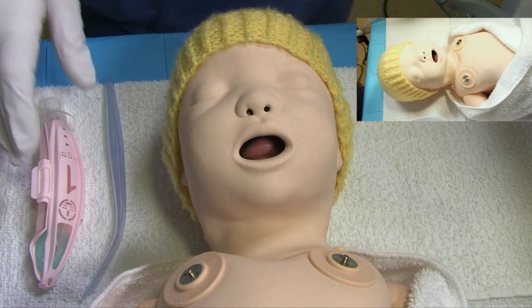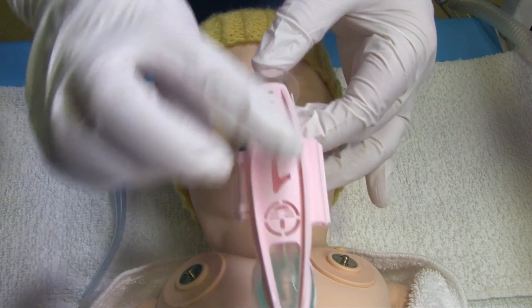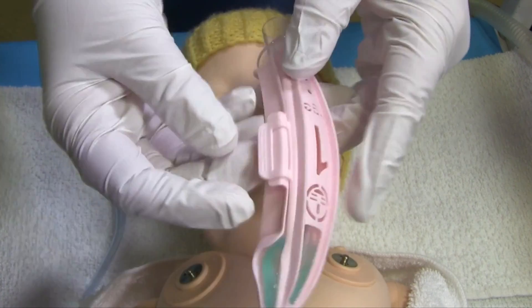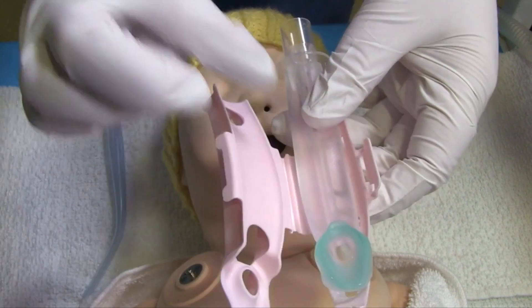Today I'm going to demonstrate insertion of an iGel. iGels come in a case similar to this. As you can see, nice and clearly, there's a size one. You open the case and inside this is your iGel.